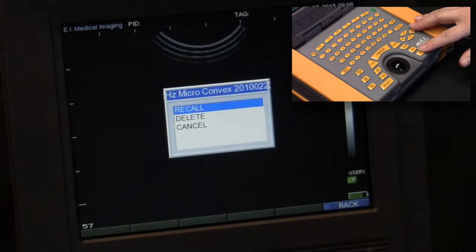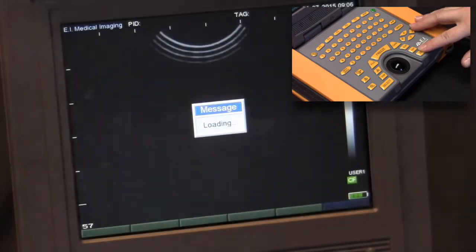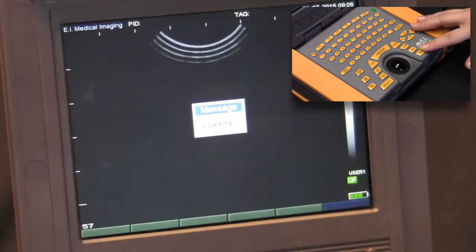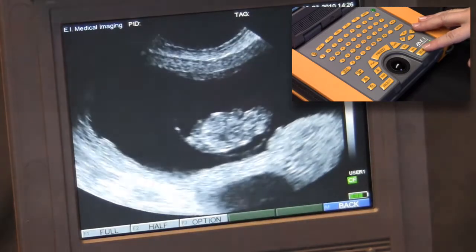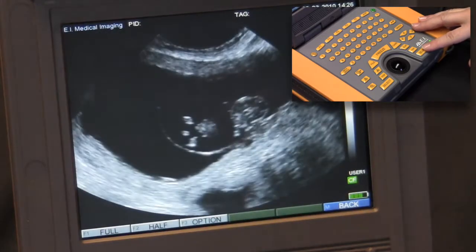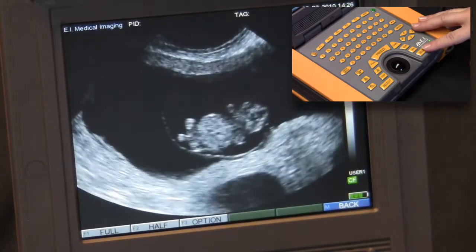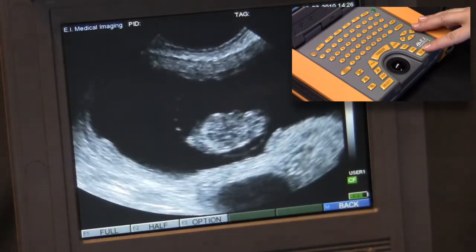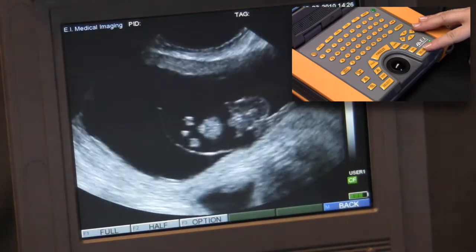This is approximately a 40-day bovine pregnancy. I'm going to walk you through taking linear measurements, annotating on the screen, and saving this image as a separate file from the original clip.